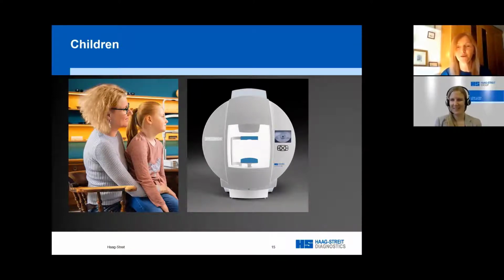In reality, though, if you just remove age, the indications for kinetic testing are the same for many of our acute neurological cases. So you need cognitive demand, attention, ability, and fatigue, all of those factors to be taken into consideration. So for children, if children can understand instructions and their behavior is good enough, they'll do static testing very well in general. But showing understanding and being well behaved do not always apply, as those of you who work with children or those of us who are parents will know.